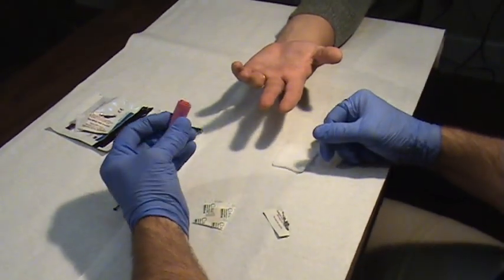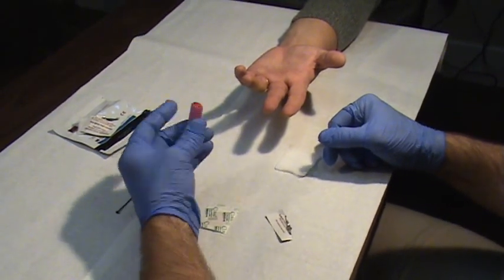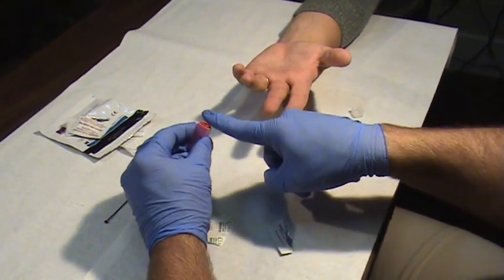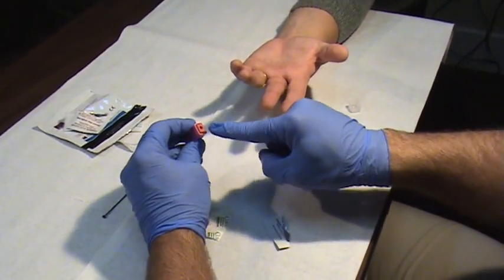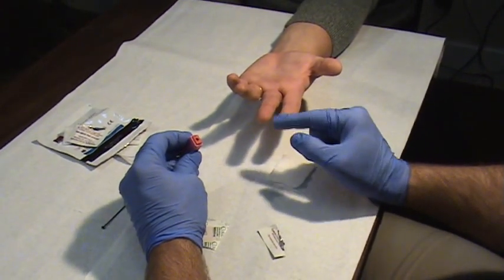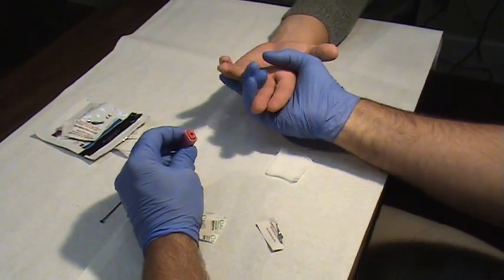This is a one-shot plunger. You push it firmly against the skin on a flat surface. You want to have this be completely flat and it just is a jab from the needle that will cause the blood to be drawn.